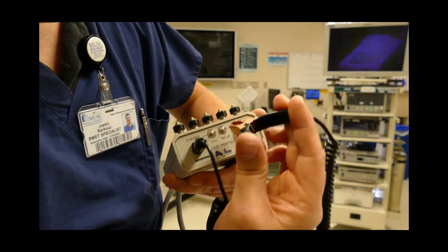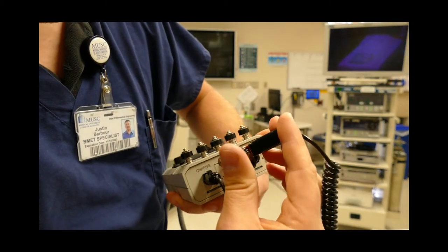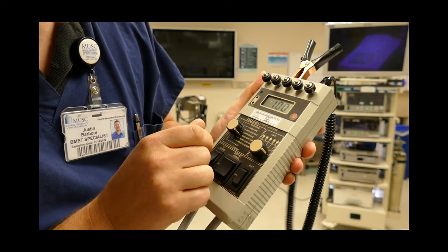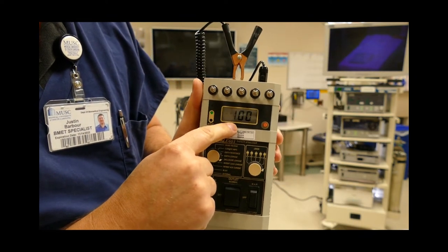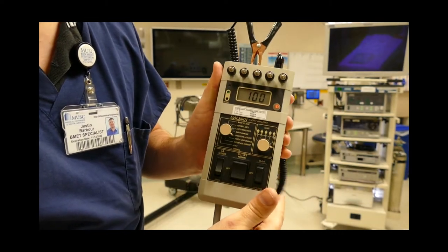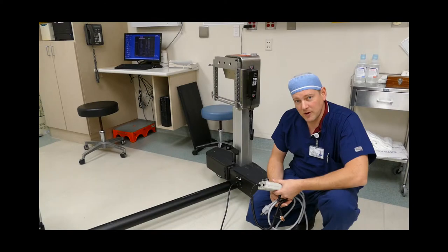Then we're going to switch it over to 100 microamps — click it on there. Take your meter down to enclosure leakage and you should see 100 pop up on the screen. Now we've just verified the probe and the meter are ready to rock and roll.